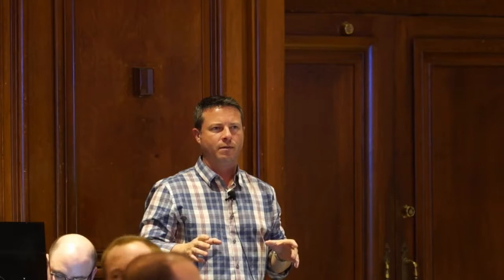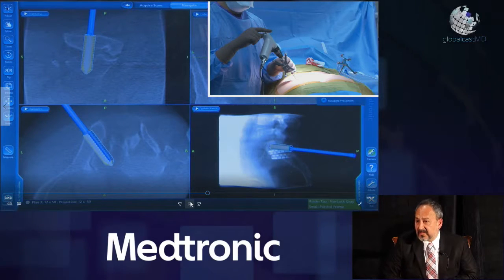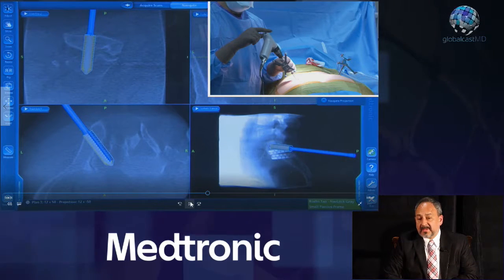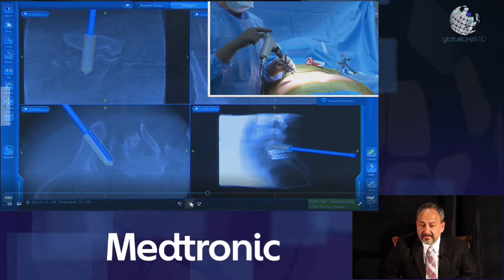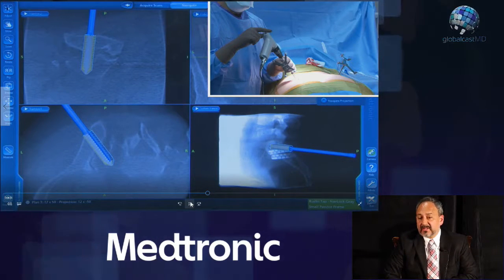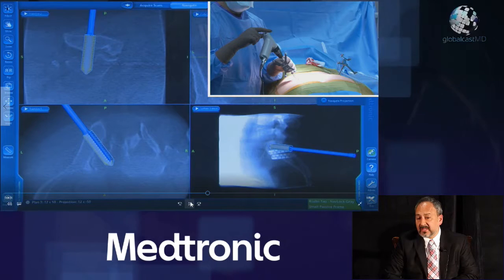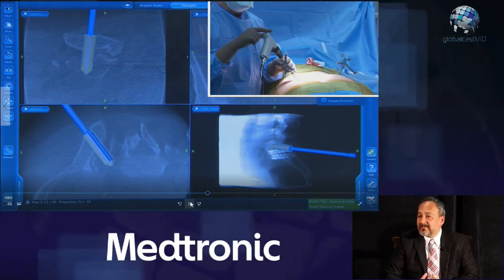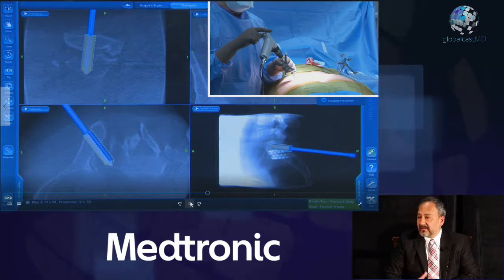Are there any best practices when it comes to patient positioning? This patient is on a flat Jackson table primarily to allow the O-arm to go around it. The patient is placed on a pad across the anterior pelvis, and other than the patient being prone and padded, that's really the only different thing we would do — very similar to setting up a patient with preserved lordosis for a lumbosacral fusion.